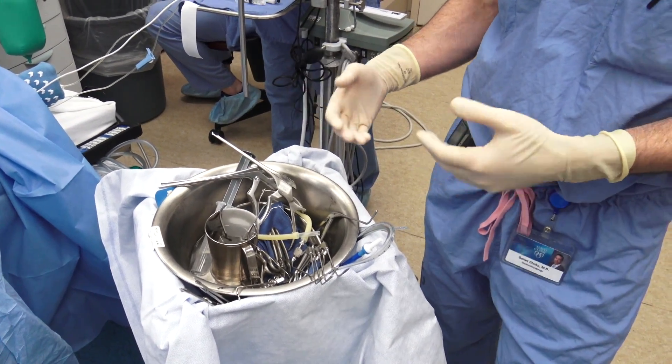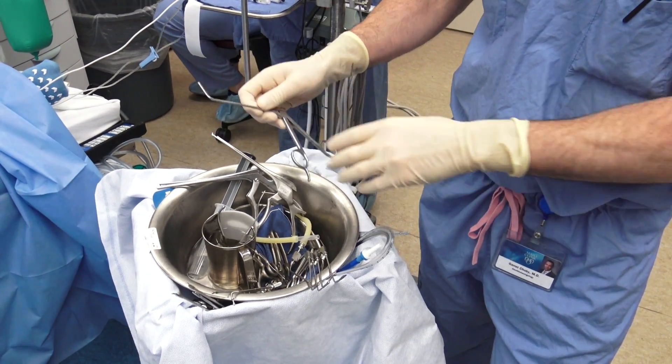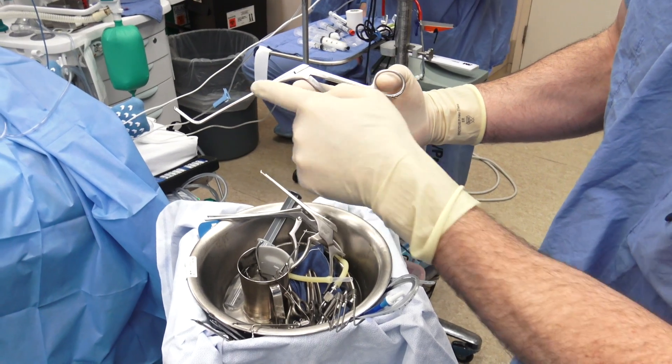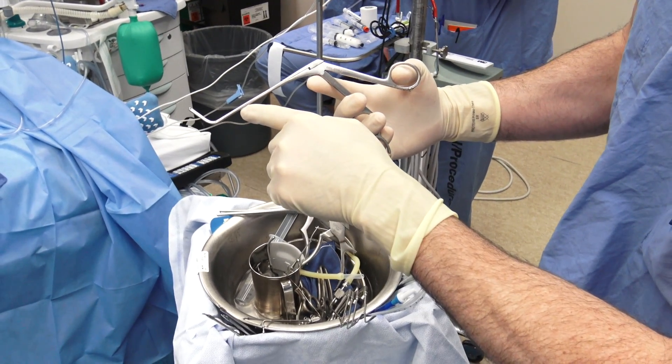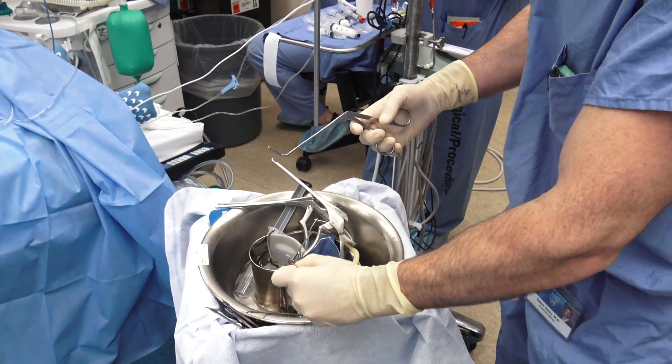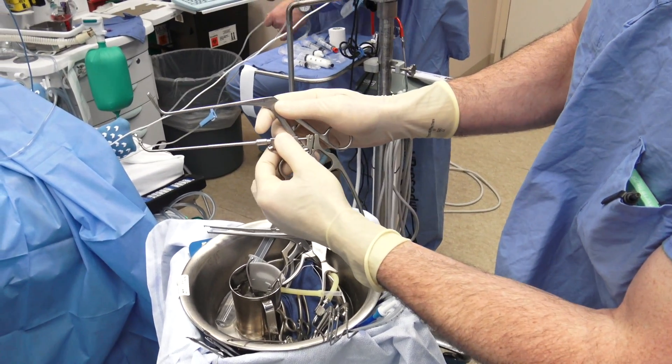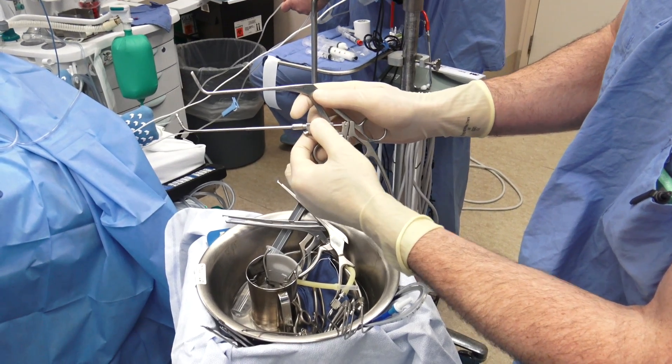Our frontal sinus instruments all have a nice curvature to them. This is called the frontal pediatric Kerrison, also known as the cobra — you can see that curvature there to allow us to access the frontal sinus. This is a similar instrument called the frontal Hoseman punch, which has a similar curvature to access the frontal sinus.